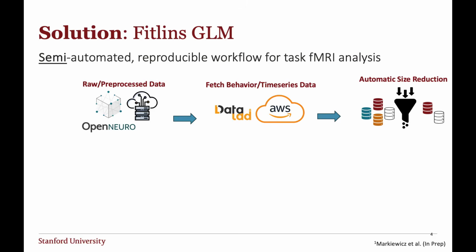Likewise for fMRIPrep, which has two formats of derivatives on OpenNeuro, minimal and non-minimal. The minimal is more recent, where basically the fMRIPrep data are not fully derived. They give you enough so you can rerun it in maybe 15 to 20 minutes per subject. Nevertheless, non-minimal derivatives generate files that are pretty large, and they're oftentimes unnecessary.